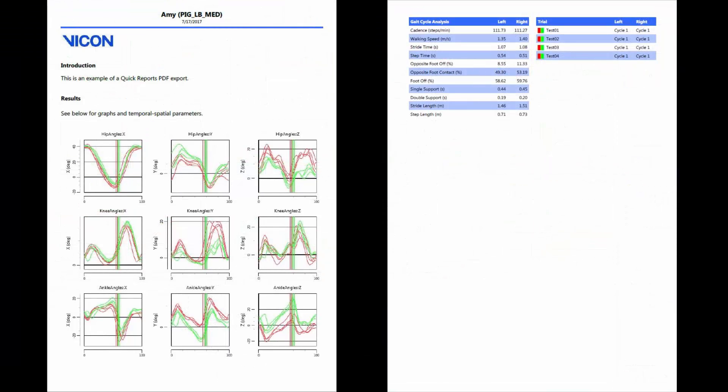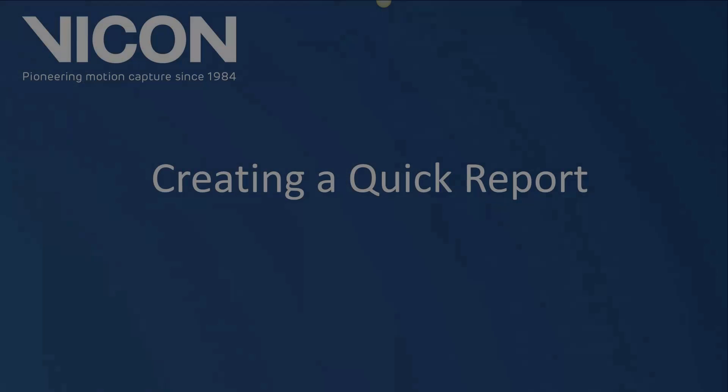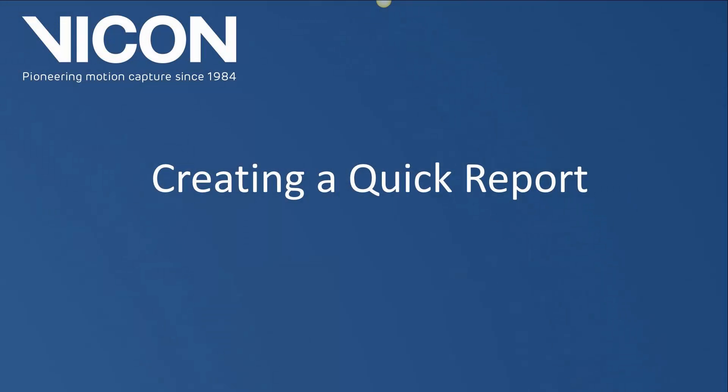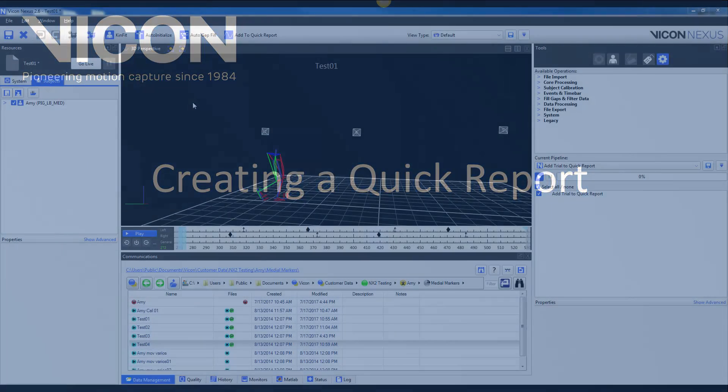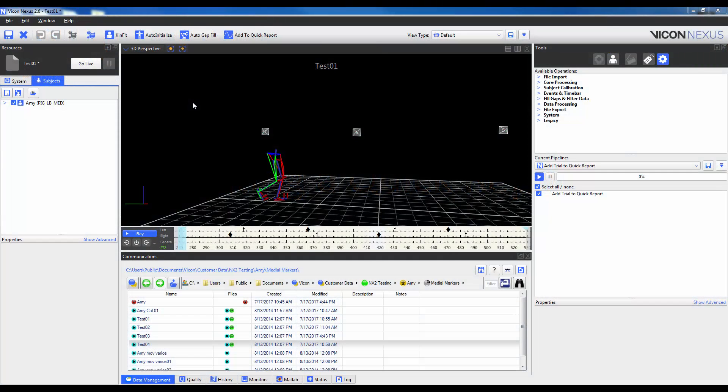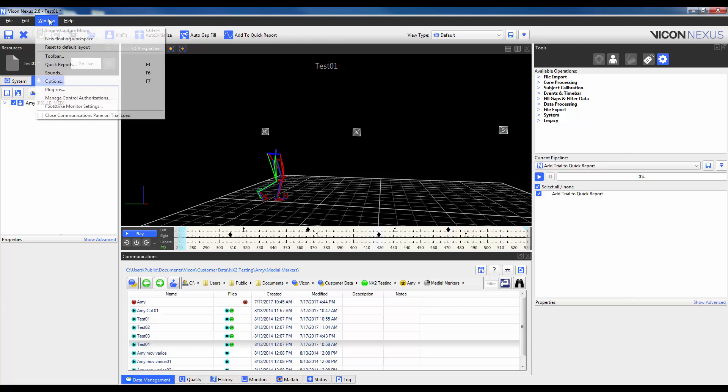When finished creating the report, a PDF can be exported so that the sharing of information can occur much more quickly and seamlessly. To access quick reports you can go to window and select quick reports. Alternatively you can press F4 on your keyboard.